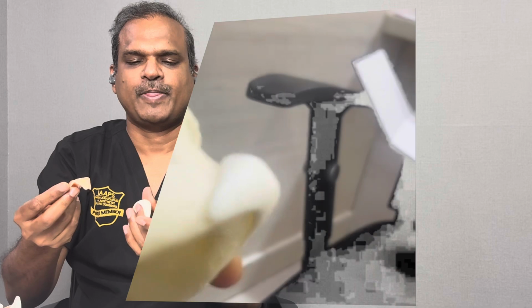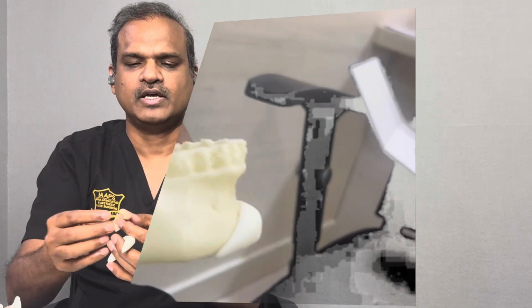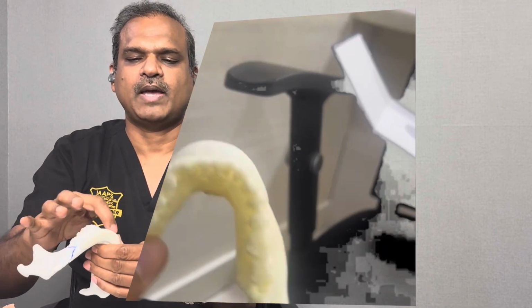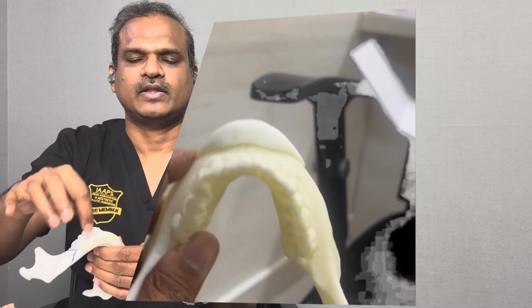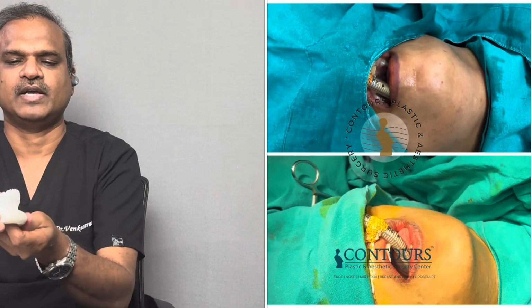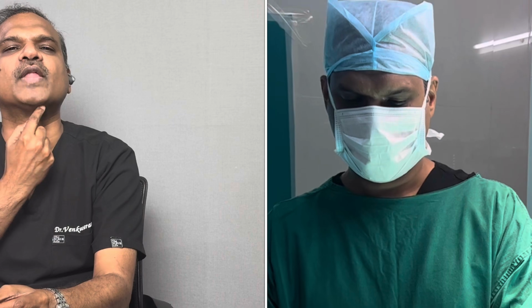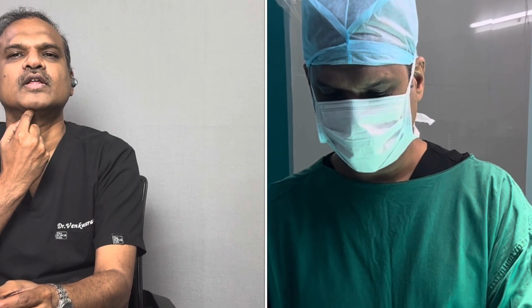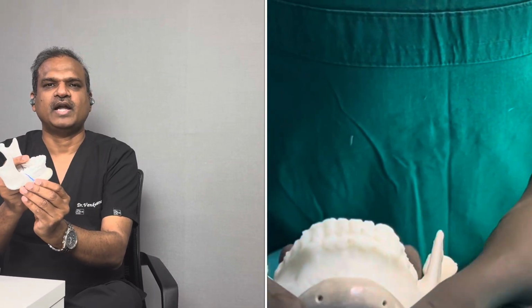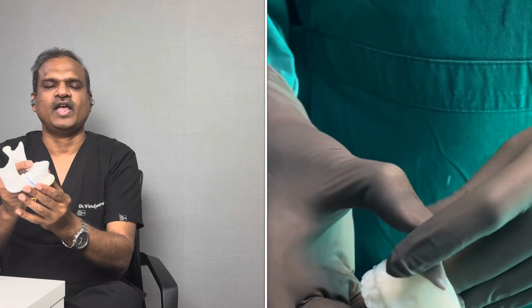We can't use sizes which we can't insert in the tissues. We have to plan accordingly and then insert it orally, from the inside. By making a cut here, we'll fix it, and then we'll fix it with titanium screws which will stay permanently. It can also be done from the lower part, from the neck, by an outside incision. This is how a 3D printed lower jaw or chin implant is planned for aesthetic purposes of the lower face of an individual.